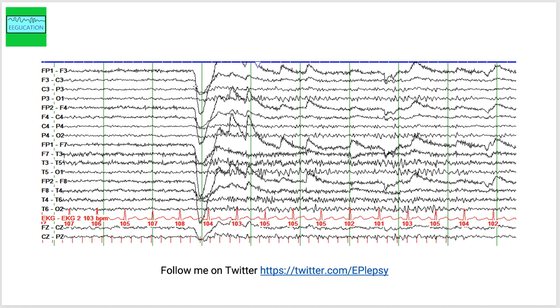This big deflection here tells you that the eyes are closed here. You start seeing some fast activity in the background here and you wonder if this person has a photoparoxysmal response or sensitivity to flashing lights.